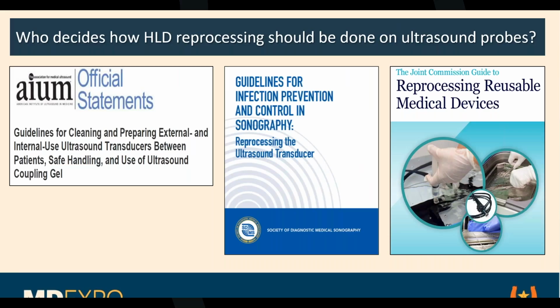It's a guideline for cleaning and preparing, external and internal use, et cetera, and also coupling gel. We do a lot of testing at our facility as well on gel. Because you're using gel, if you don't clean it off correctly, that gel is going to pick up whatever it has and go to the next patient. You can't just think you're wiping it off and all's good, or wipe it on your shirt, whatever. I know you wouldn't do that, but some people do.